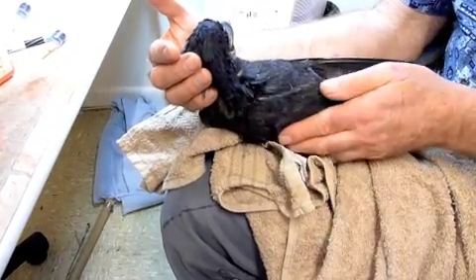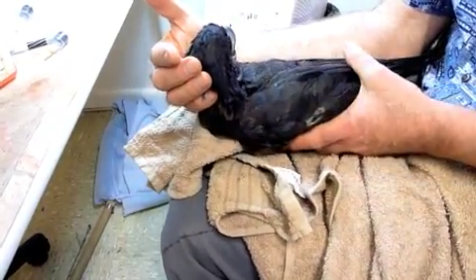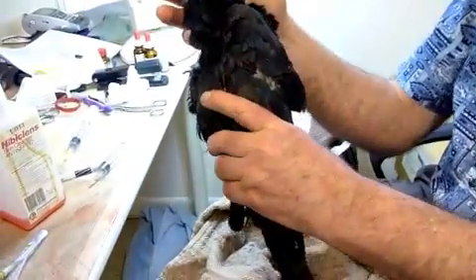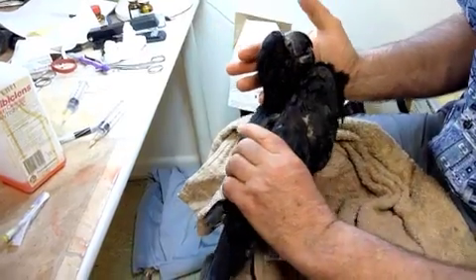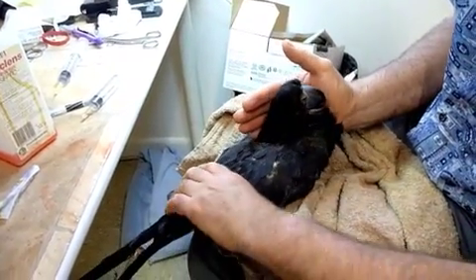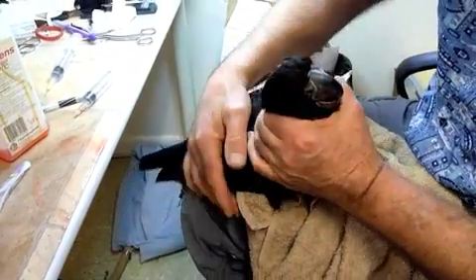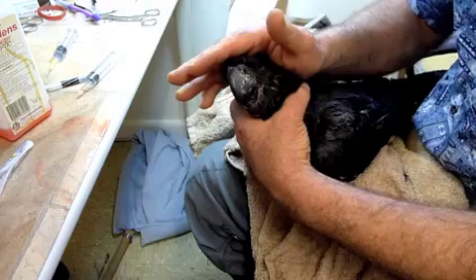Always keep pressure on a vein afterwards for a little while to get it to seal. Okay, sending him up — good boy Billy, good boy.